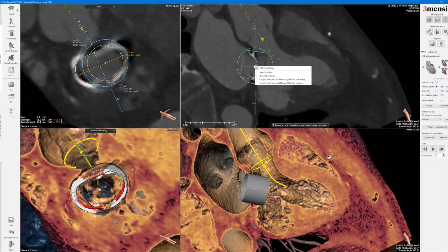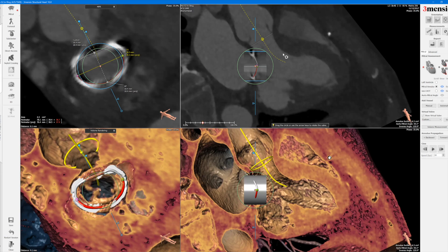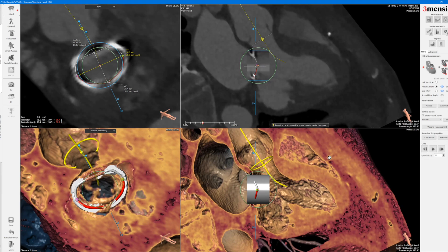Right-click here going to the top pink corner, then snap to valve and make it coaxial. Position the Sapien valve towards the ventricular direction, such as 80-20 or 90-10 as a target deployment. Keep in mind that with the valve-in-ring procedure, you have the anterior leaflet that will be displaced forward — that is where you get the neo LVOT. Depending on your final positioning, your neo LVOT might change, but this is a virtual conservative estimate.